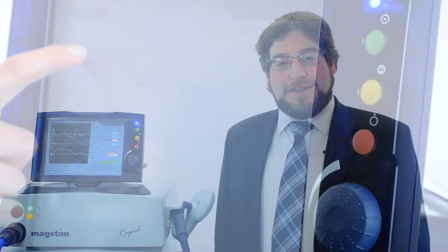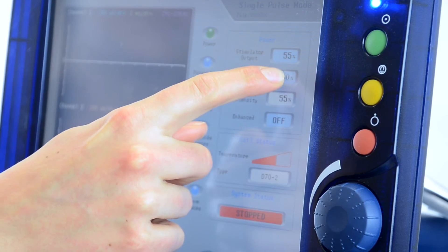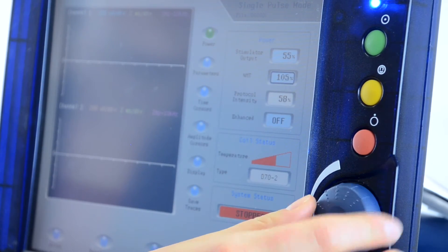The Rapid2 is capable of a range of stimulation modes. In single pulse mode, a motor threshold value can be determined and carried over to repetitive protocols.